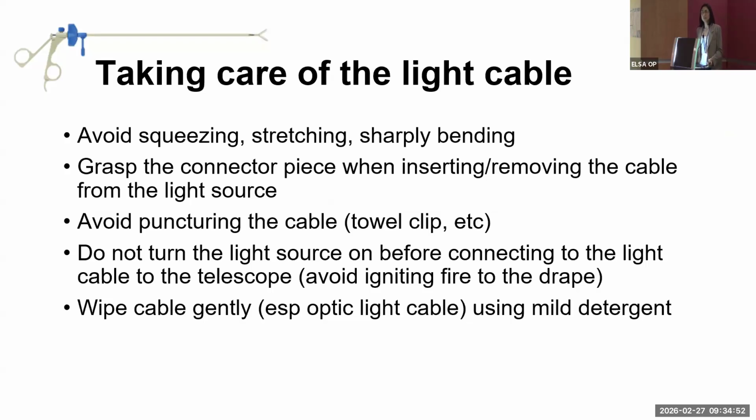Do not turn on the light source before connecting the light cable to the telescope, because sometimes it can burn the instruments and the drapes. Also, sometimes the patient, if you leave it open for too long. And always wipe the cable gently, especially the optic light one, because it breaks easily. It's a little more fragile compared to the traditional fiber optic cable.